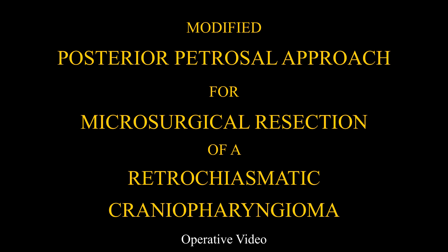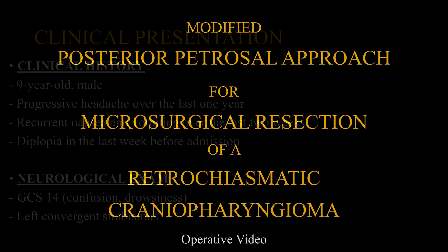This video demonstrates the microsurgical resection of a retrochiasmatic craniopharyngioma through a modified posterior petrosal approach.